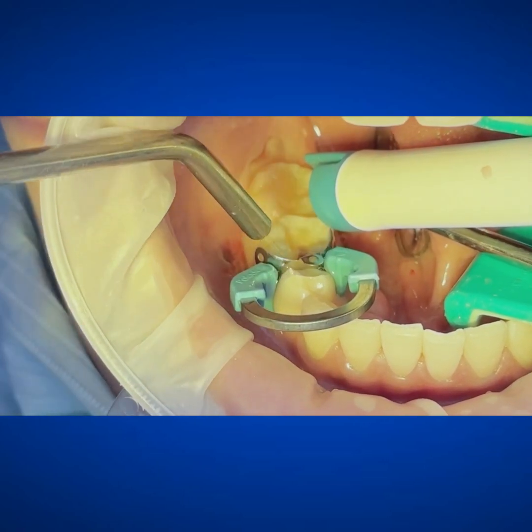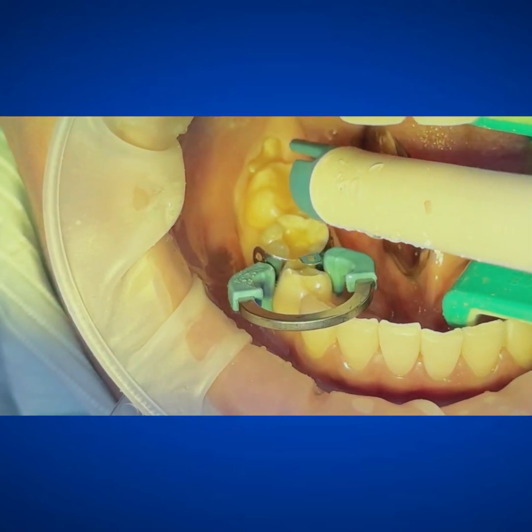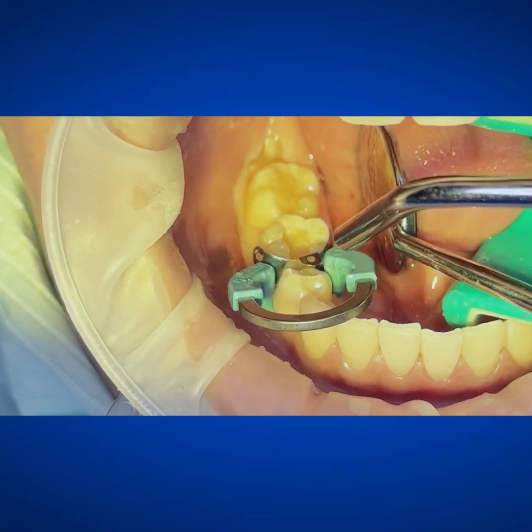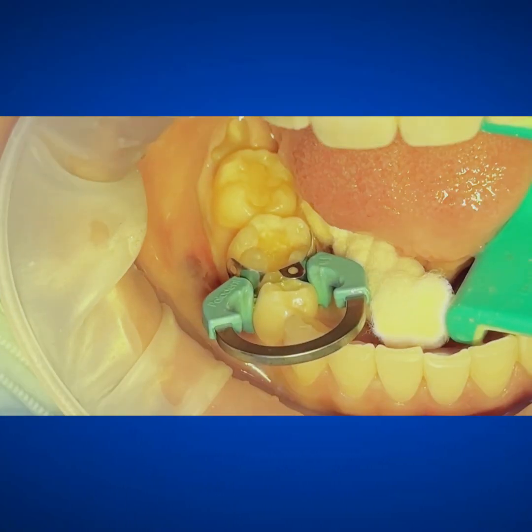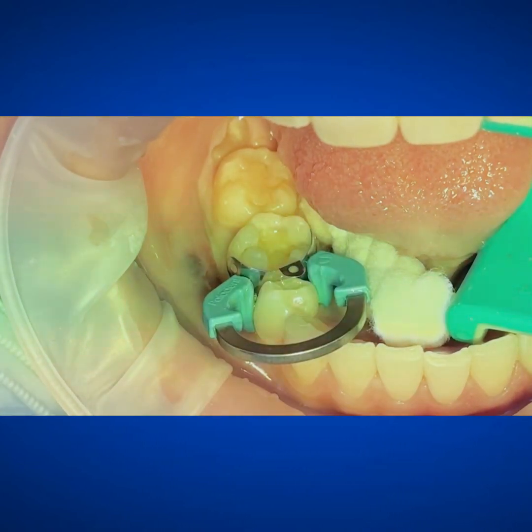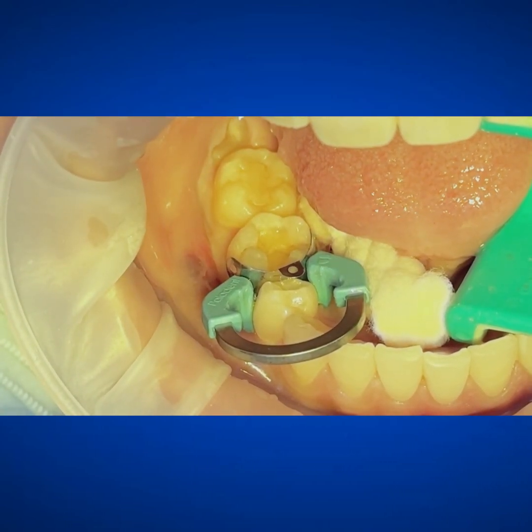You don't have to etch because I'll show you the adhesive, but I'm just a creature of habit, old school. The Kerr etch is great — I love the viscosity, you can see it really well, and it just moves well in my hands, plus it comes in these great little syringes. I'm going to go ahead and use any sort of desensitizer, especially if we're on dentin — antimicrobial. I use Microprime; you could use Glooma, things like that. Do whatever works well for you.